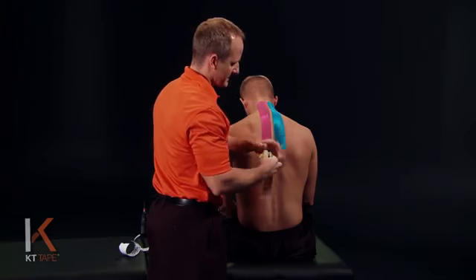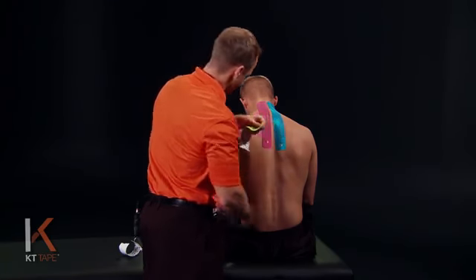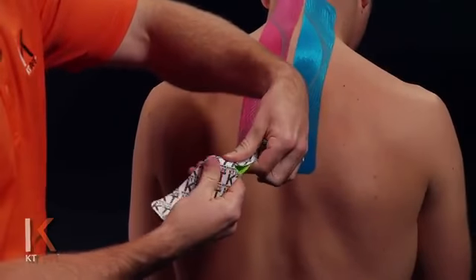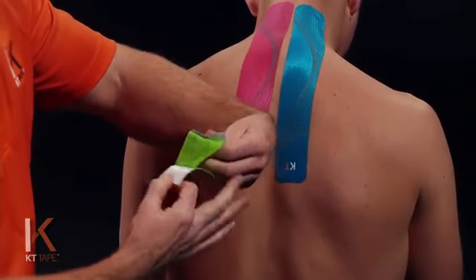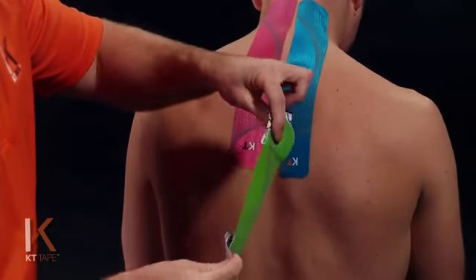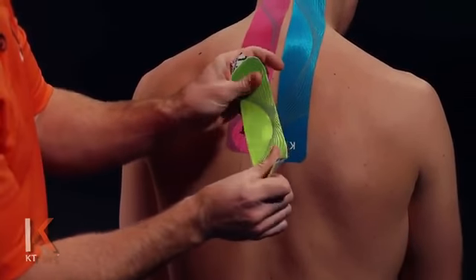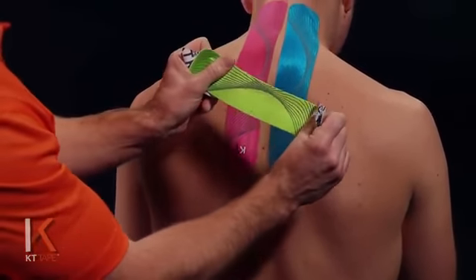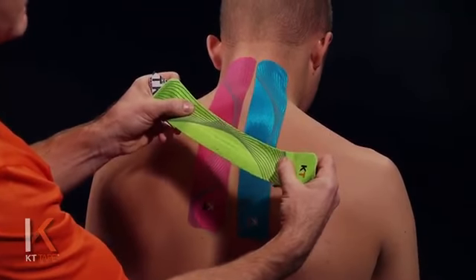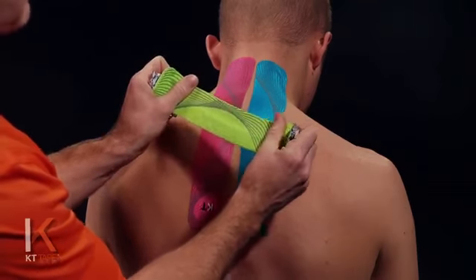Okay, just like the first two, I'm going to take a full strip. This time I'm going to twist and tear the paper in the middle of that piece, and I'm again being very careful not to touch the adhesive of the tape. I'm also going to apply a stretch through the middle of this piece, and how I do that is nice and evenly with my thumbs. I'm not trying to pull in the middle of the tape, but putting my thumbs flat.